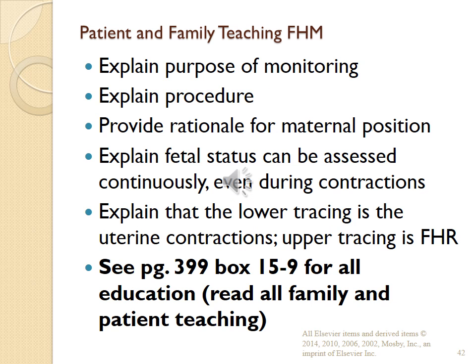Patient and family teaching about fetal heart rate monitoring. Explain the purpose of monitoring, explain the procedure, provide rationale for maternal position. Explain fetal status can be assessed continuously even during contractions. Explain that the lower tracing is the uterine contractions and the upper tracing is the fetal heart rate. See page 399, box 15-9 for all education. Read all family and patient teaching.